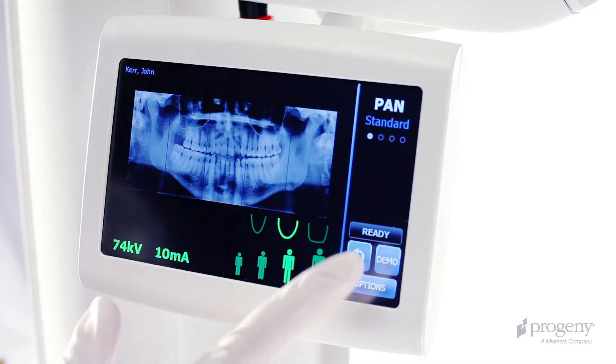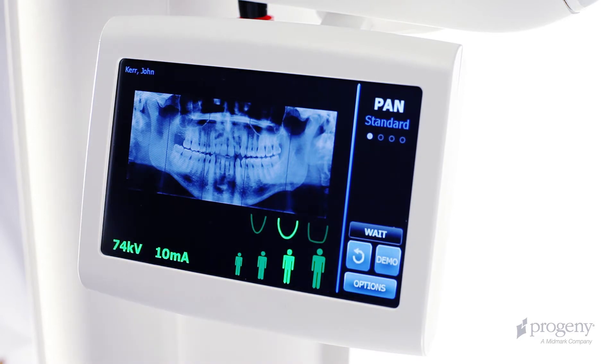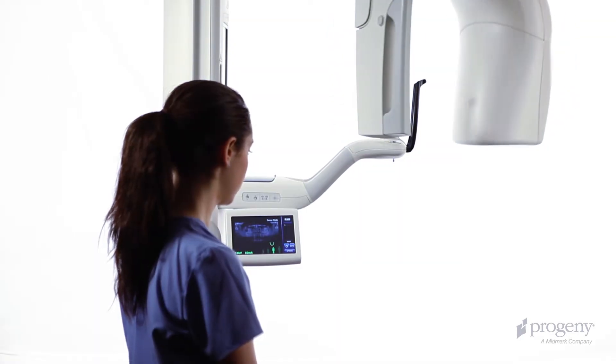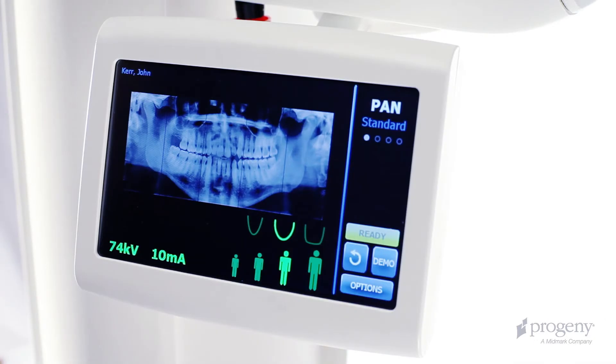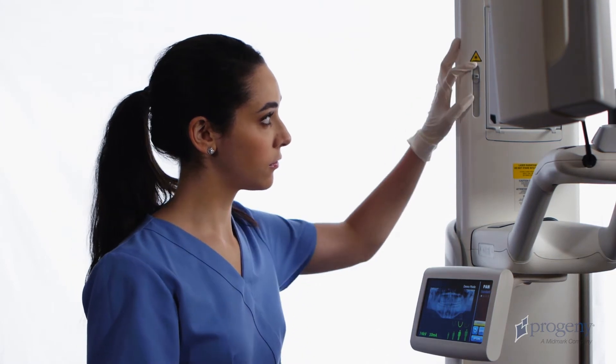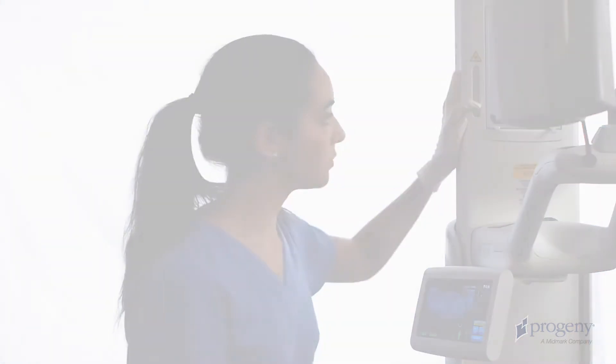If necessary, tap the cycle key on the Vantage Touch to bring the overhead to the patient entry position. Then verify the yellow ready indicator. Place the Frankfurt plane laser in the lowest position.